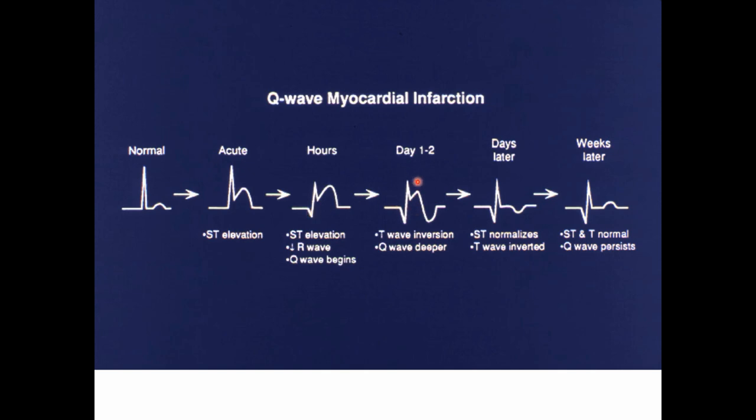और कुछ जब 1 या 2 दिन गुजरते हैं तो T wave इन्वर्जन ऑफ द टी वेव होनी शुरू हो जाती है, और क्यू वेव की जो डेप्थ है वो बढ़ जाती है, और कुछ दिनों के बाद क्यू वेव एस्टैब्लिश हो जाती है, एसटी सेगमेंट अपनी नॉर्मल हालत में आ जाता है, टी वेव की इन्वर्जन परसिस्ट कर सकती है, and ultimately the T wave inversions can also disappear, and the final evidence of an old infarction is the presence of Q waves after a few weeks later. So ये जो Q waves pathological Q waves बाकी रह जाती हैं, ये हमें old MI को शो करती हैं.